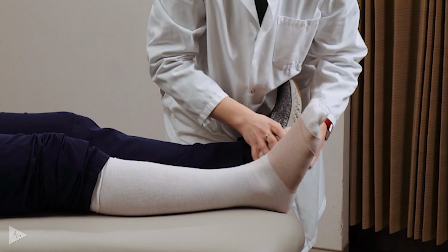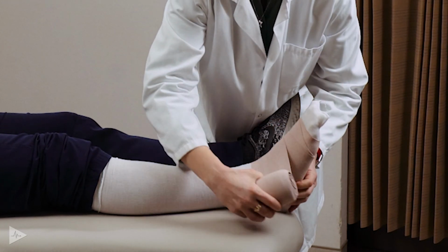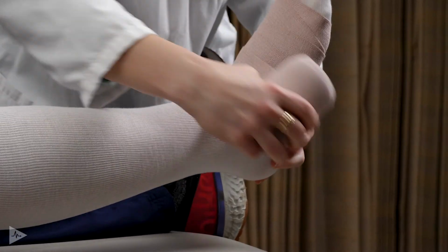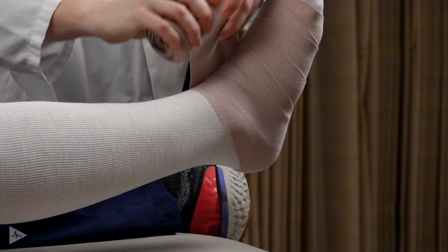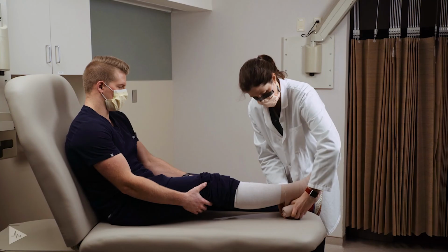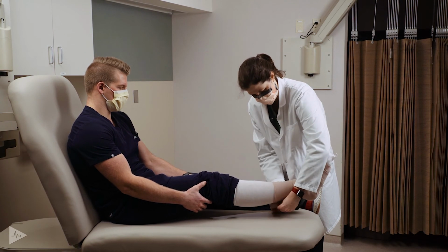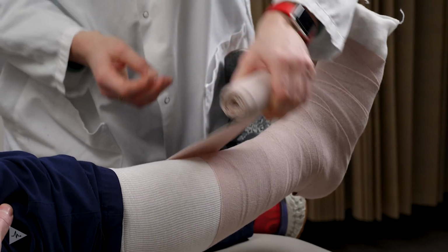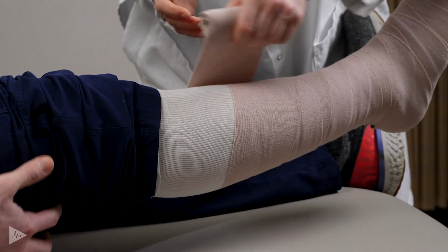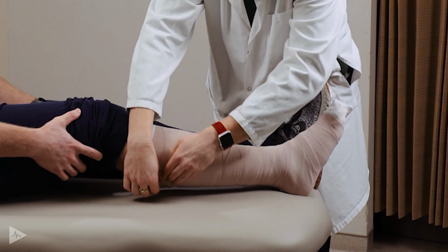And as we bring that through the foot, we just want to maintain that stretch as we're going around. So again, check your stretch when you come back through. As we're coming up the leg, then we will want to try to decrease that stretch a bit, because we're wanting to try to mimic that pressure gradient like we find in compression stockings. As you can see, not much stretch as we come up the leg. We're decreasing that as you come closer to the knee area. Again, we will secure with tape.